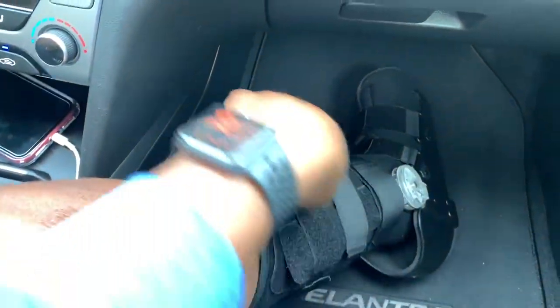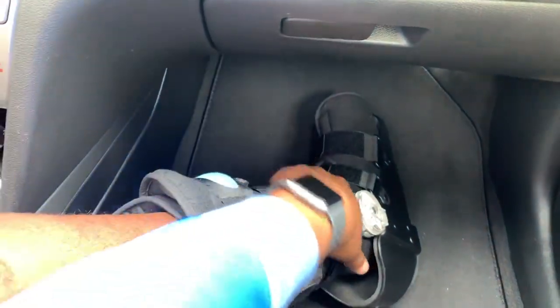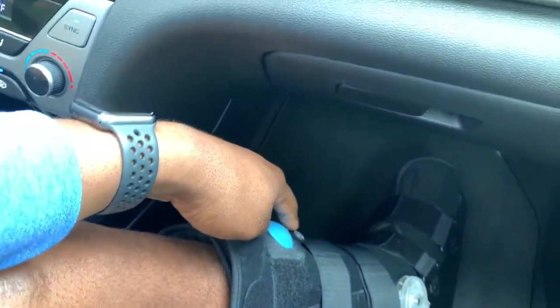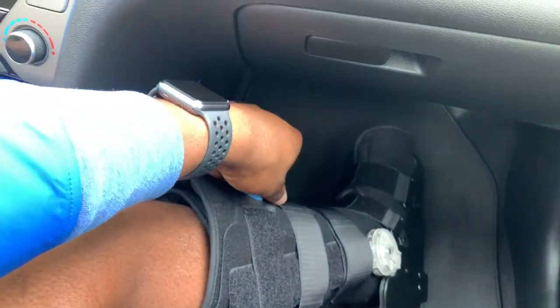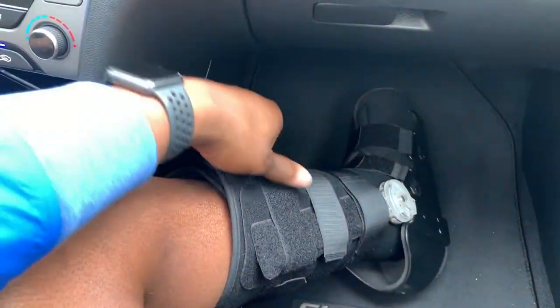And then this blue bubble right here is your air. So it pumps up air, fills up air on the sides — not too much down in the ankle part, but mainly on the sides right here. And then this little knob right here is your little bleeder. So you unscrew that to let the air out, and you tighten it down when you're about to pump it up.